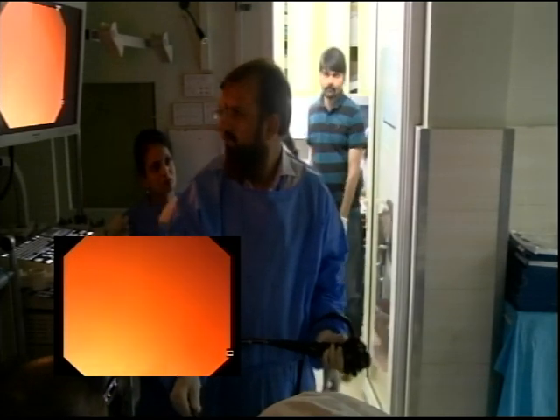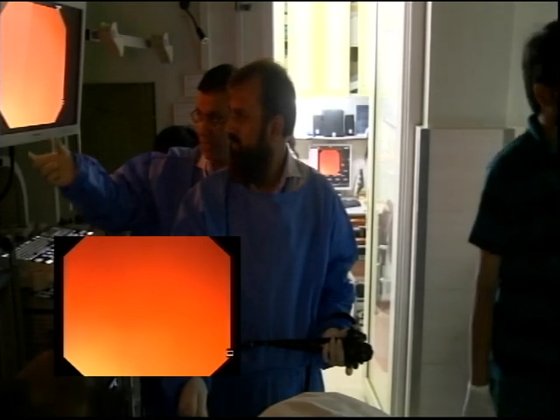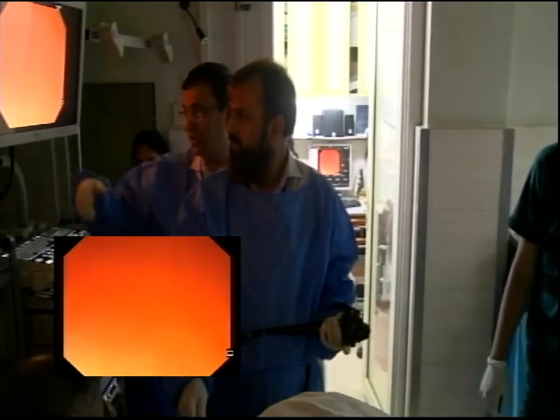No answer. Okay, do it again. This is also a very difficult case because there is not much pancreatic tissue. Is there a CT film there? Is there a junior doctor who's there, Sadaf or somebody? Is the CT film here? If it is, please bring it here. There should be a film from ARC.